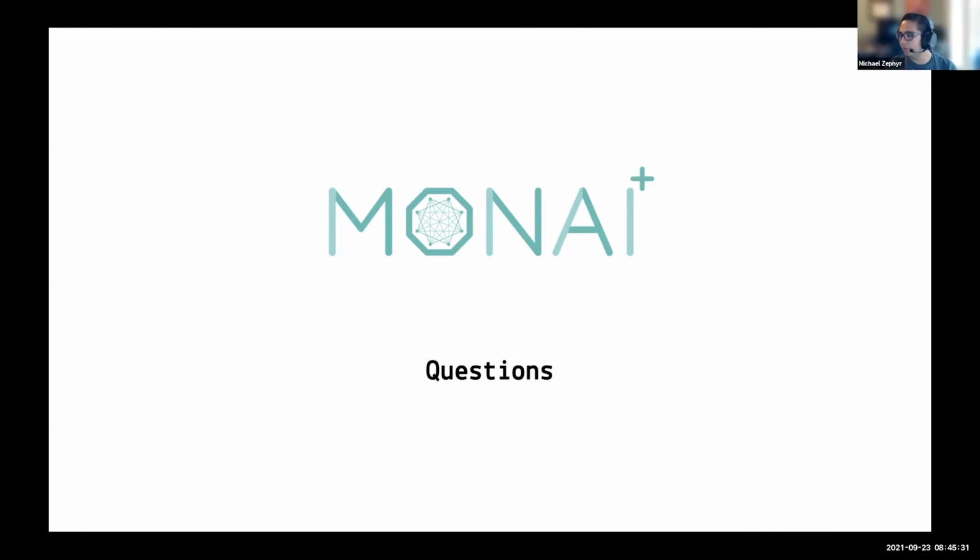I see 3 different questions here. Richard already kind of answered one of them, but someone was asking for the sliding window inference method, is it still beneficial if they have access to large memory GPUs? Oh, that's a good question. So it depends on the model and the patch size you select for training. For example, if you use only a small patch size for model training, and you want to do the inference on the entire large patch, or the whole image, normally it won't give you good performance.